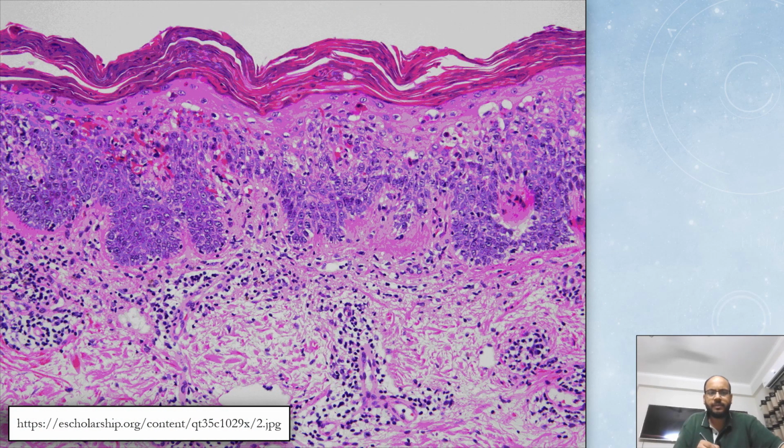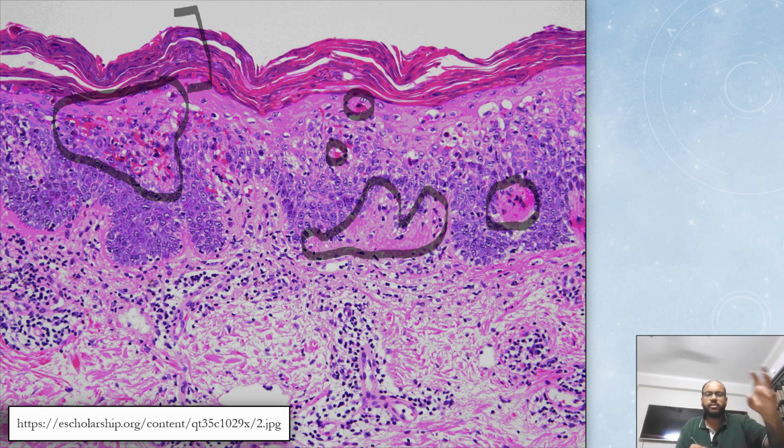This also is a better picture. You can see necrotic keratinocytes at various levels. This is at the basal level. This is a bit above. Look at this focus, you have all the layers that have necrotic keratinocytes. You have associated parakeratosis. You have significant damage leading to good colloid deposition here. So these are all features of a drug reaction.